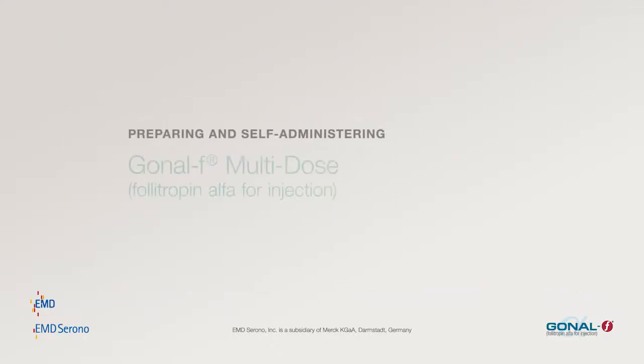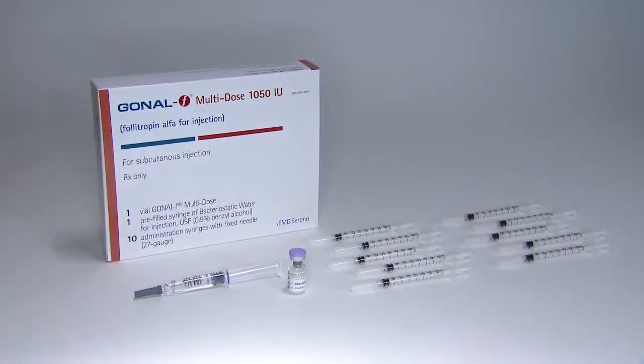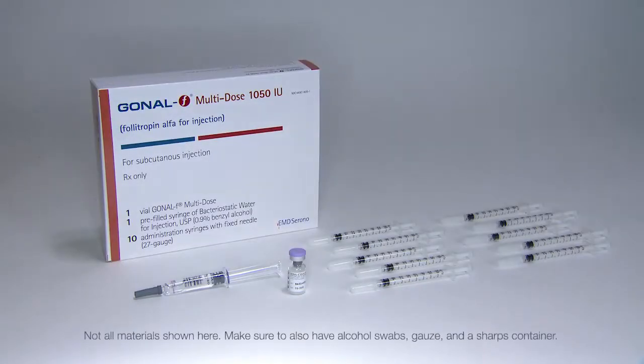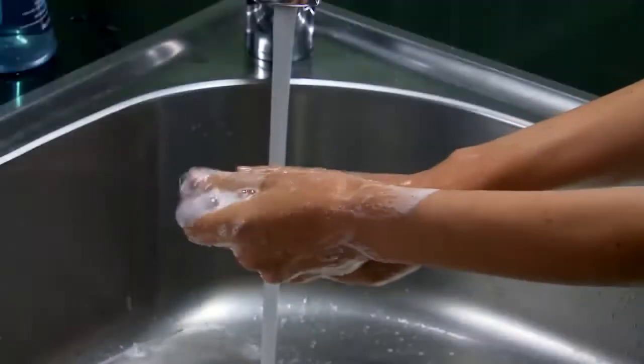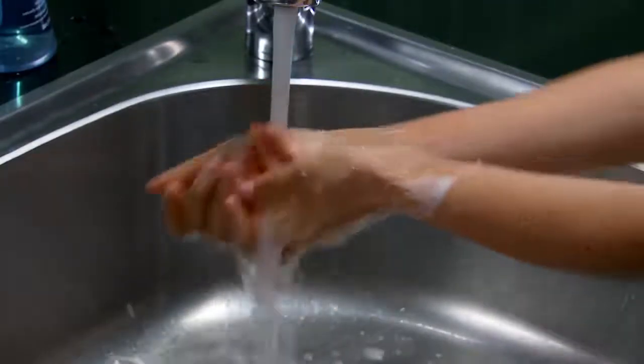Preparing and self-administering Gonal-F Multidose. Make sure you have all the necessary materials assembled in a clean area: Gonal-F Multidose powder vial, pre-filled syringe labeled bacteriostatic water for injection, Gonal-F custom dosing syringe graduated in IU, alcohol swabs, sterile gauze pads, and lastly, a sharps container. Wash your hands with soap and water and make sure you are working on a clean, flat surface.